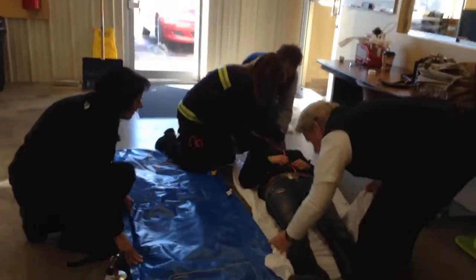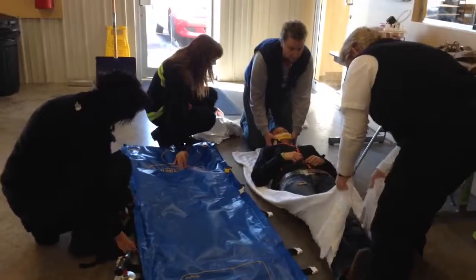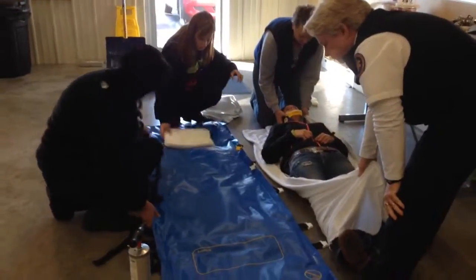That's a great idea, Lori. Or you might be able to get the edge of the vacuum splint and you could slide her across using the blanket right onto it, instead of picking her up — if you want to save your back.